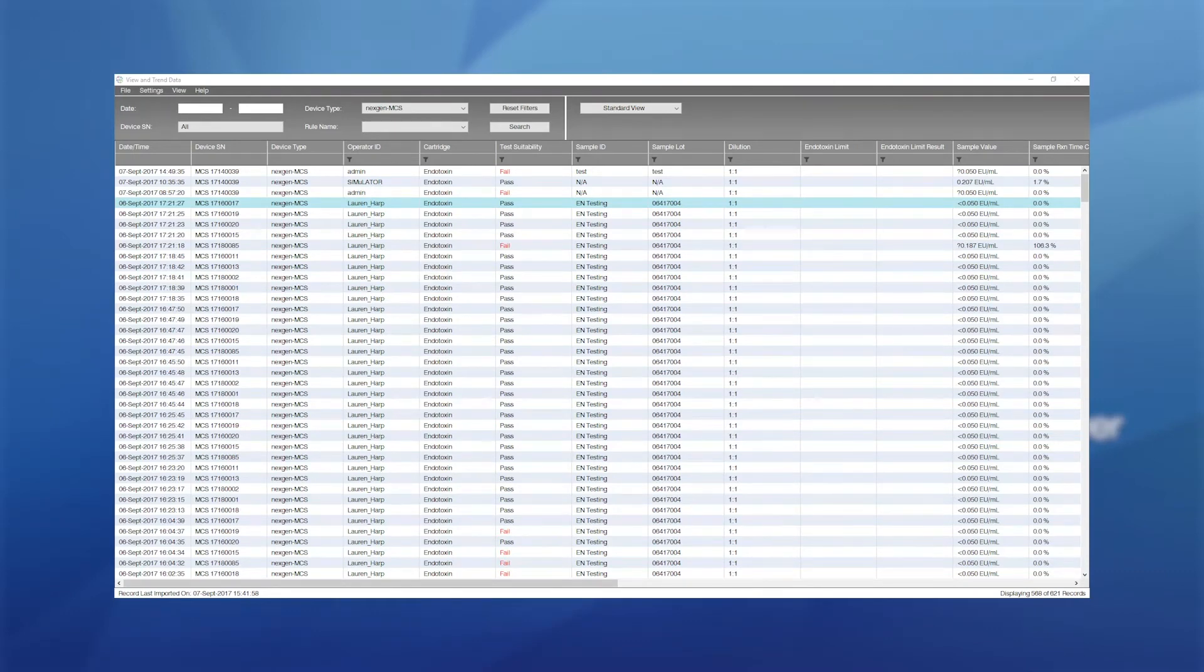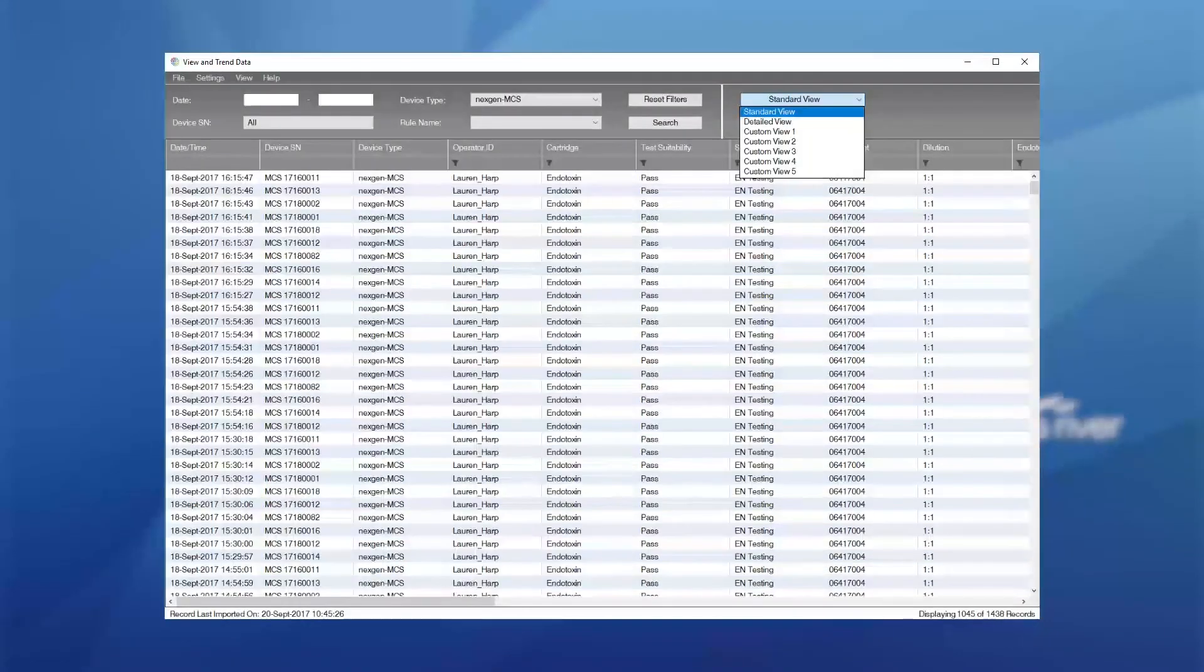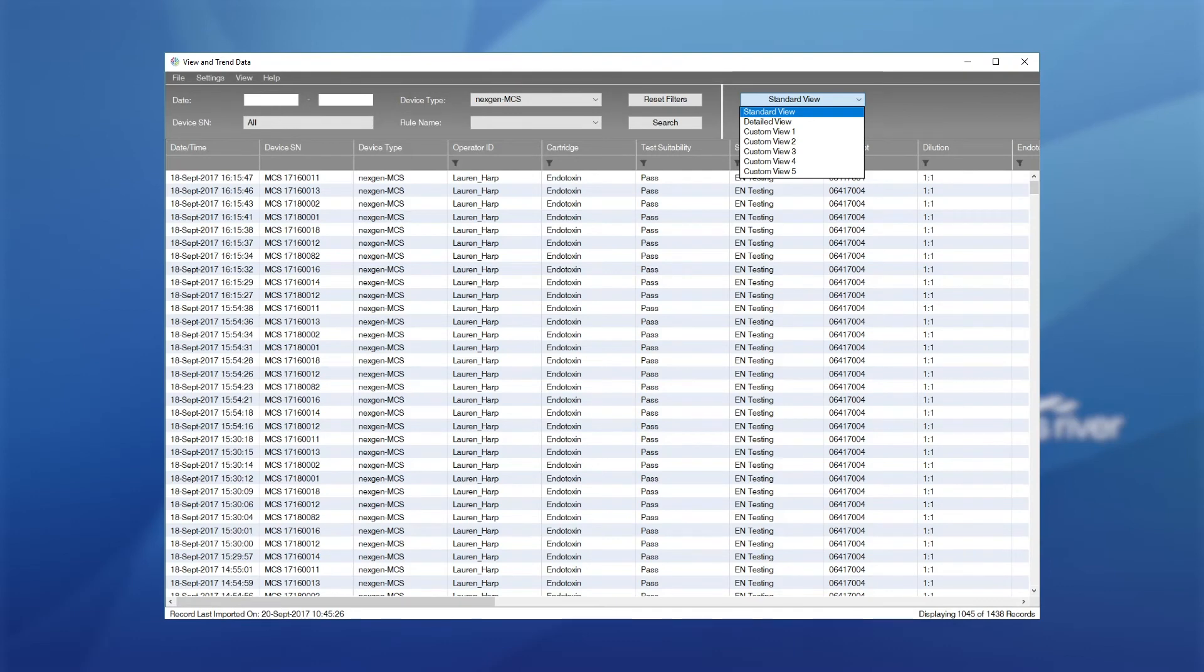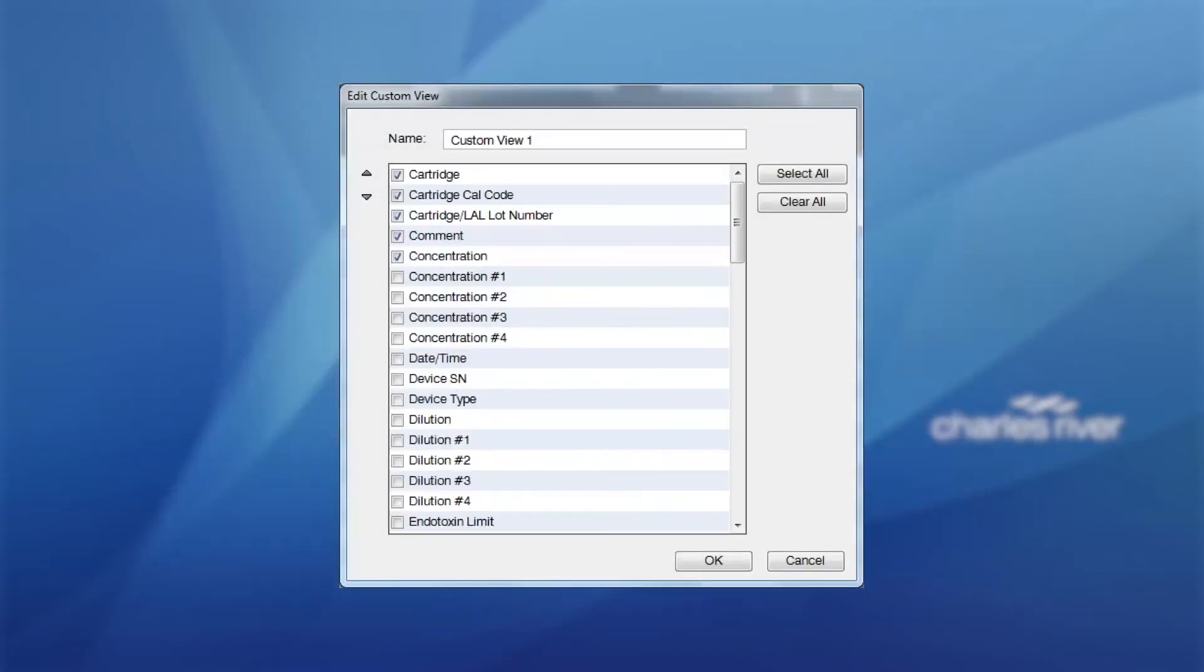Please note, the user must document if they will print and sign reports in Cortex or in EndoScan-V. They cannot do this in both. This data can be filtered further to include only the columns of data the user wishes to see. The user can carry out this function by clicking on the view drop-down box in the top right-hand corner of the main view and trend data screen. Click on custom view to edit the view you wish to customize. This custom view can then be named.